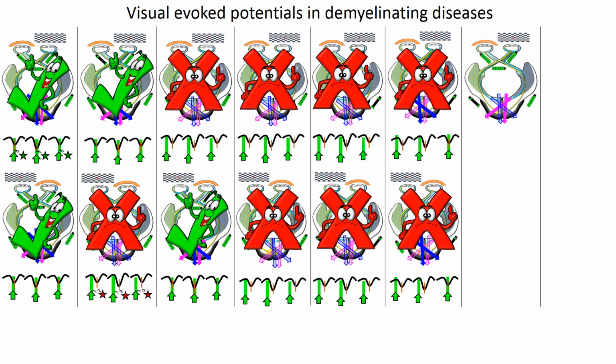The new figure I have just introduced depicts a demyelinating lesion in the left retrochiasmatic region and the vector produced by the right eye stimulation. As you can see, represented by the transparent blue arrows, the vector arising from the side of the lesions are delayed, producing a delayed parasagittal P100 in the opposite side to the lesion and a delayed sagittal P100, but not delaying the left parasagittal P100. So the study is also abnormal.